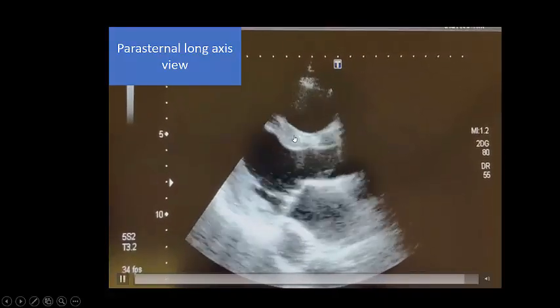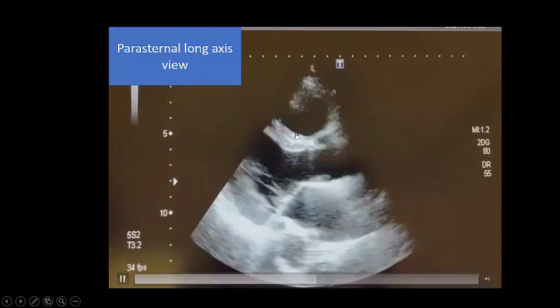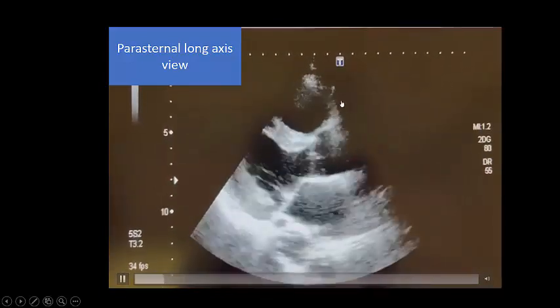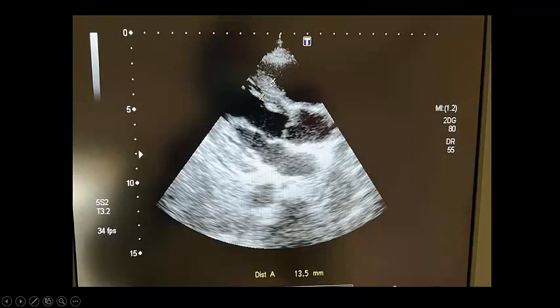In the parasternal long axis view, you can see a thick ventricular septum with good contraction. The right side is dilated here as well. The M-mode ejection fraction is 63%, which is normal, and the ventricular septum measures 13.5 mm. Could this be diastolic dysfunction with back pressure through increased left atrial pressure causing pulmonary hypertension?